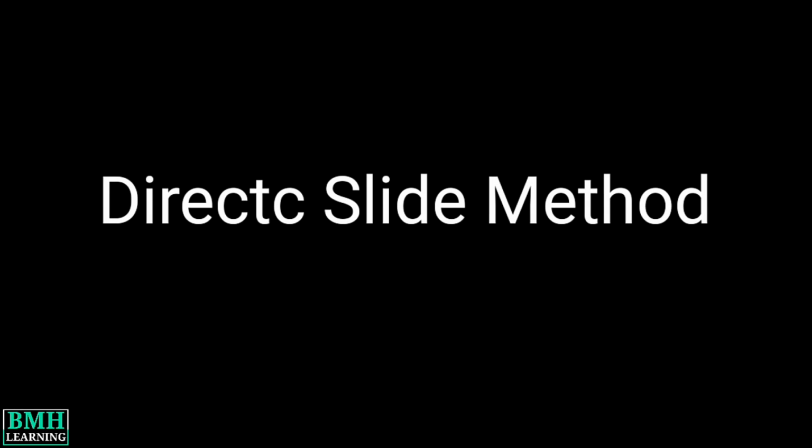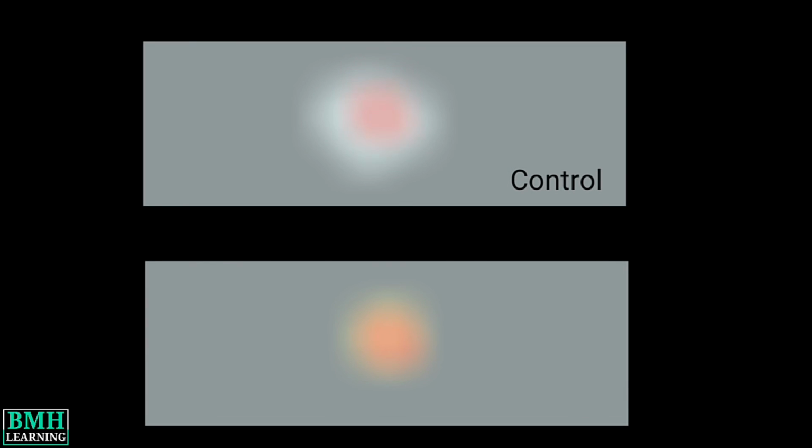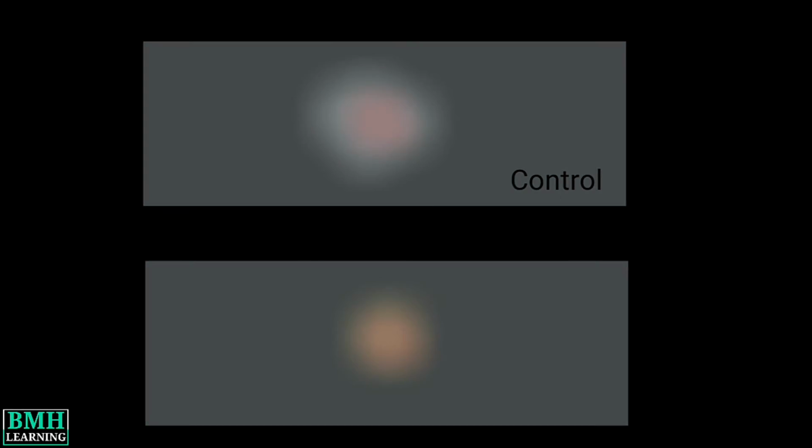Direct slide blood culture test. 1 drop of blood culture broth is added to 1 drop of bile reagent on a glass slide and allowed to dry. As a control, 1 drop of broth blood culture is added to 1 drop of water and allowed to dry. The resulting suspension is gram stained and examined for cocci.